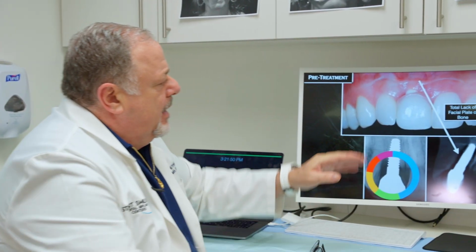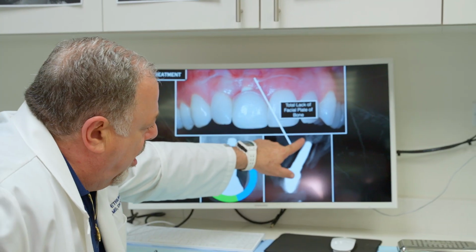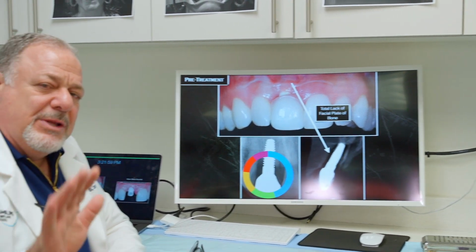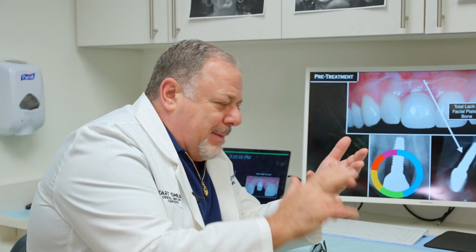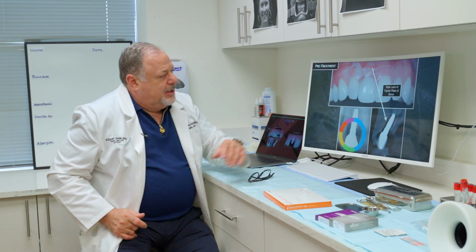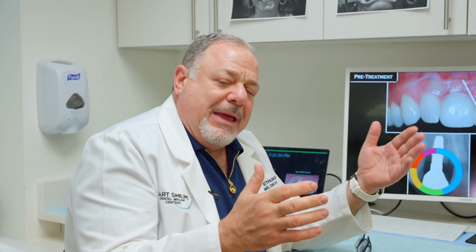We're seeing that, again, this is one of the things you see with zirconia as a material. Even though there is no bone at all on the outside of the implant, look at the tissue health, okay? Now, if that was titanium, you wouldn't see that. You would see inflammation, you'd see the metal through the tissue, and a much more difficult tissue to deal with, okay? She does have very broad papilla. She's got blunting of these papillas from surgery. So again, I really don't want to incise and flap this back if I don't have to. So if I can manage this conservatively, I really want to try. It's no problem if we have to flap, we will, okay? But we're going to try to go through it conservatively at first.